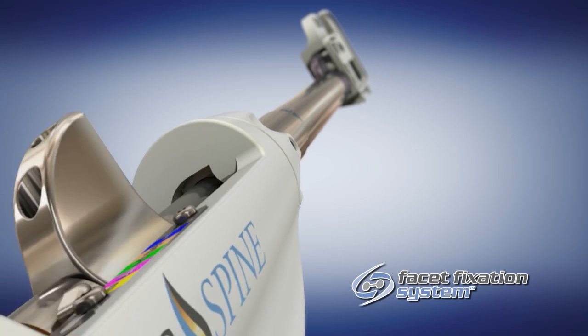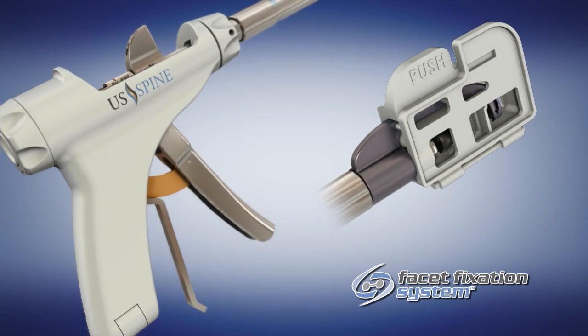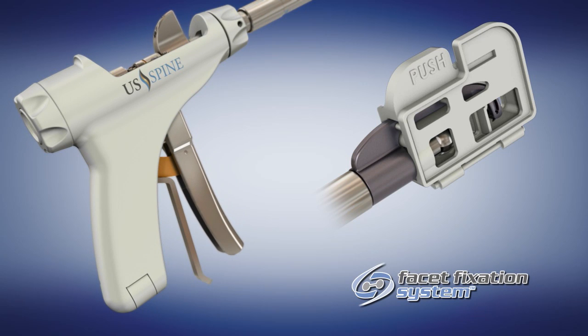Next, with the roll controller in vertical position, grasp the handpiece and compress until the barrel has captured the proximal washer.